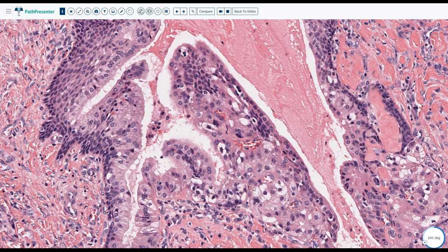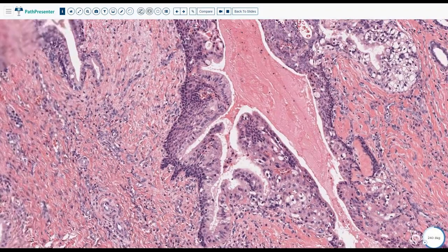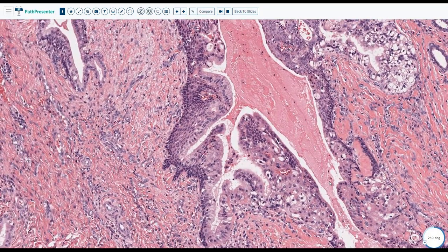The second thing is, actually we see necrosis. We see necrosis in mucoepidermoid carcinoma. It is still cancer, and we may see it. But usually we don't see intercellular bridges between these cells, because they are not really squamous cells. They are squamoid. They are similar to squamous cells, but they're not really squamous cells. Excellent. So intercellular bridges, we don't see that, and we don't see keratinization.